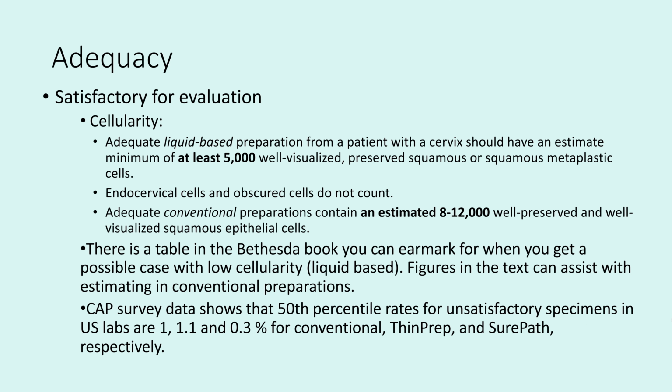In the past, they were held to the same standard and then frequently resampled because the clinicians were being told they were unsatisfactory, which led to problems because radiated tissue can be pretty friable and they're a little bit harder to manipulate and sample. Additionally, postmenopausal women with lots of atrophic change and low estrogen states can have trouble with cellularity, and then constant resampling of them can also be problematic.